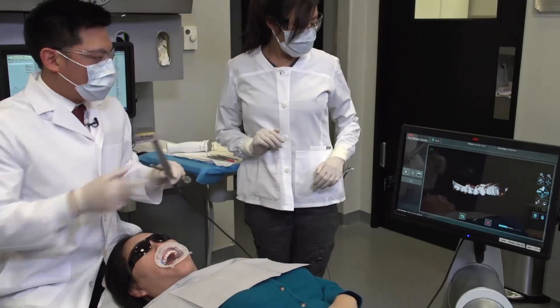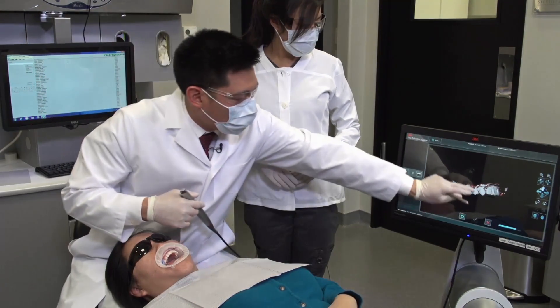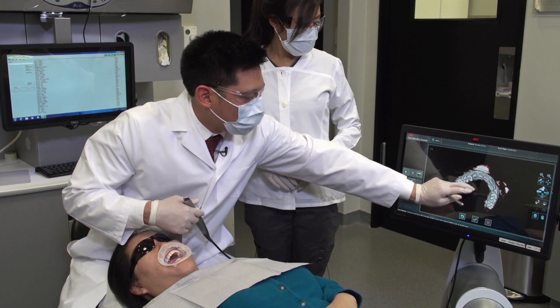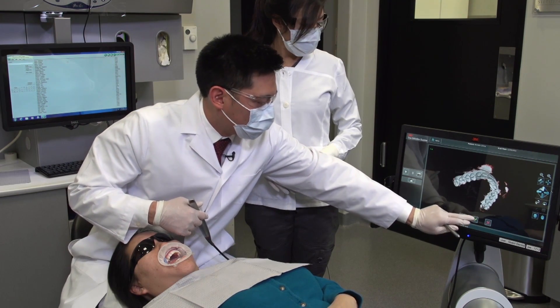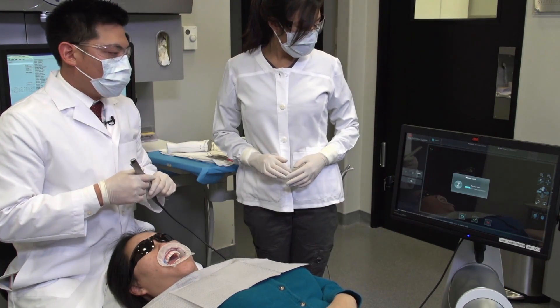We now have our completed maxillary model. I want to evaluate and ensure that all of the critical areas for this case are captured. In this case, we have all of the occlusal areas, buccal and lingual. We'll go ahead and accept the file. The next step will be to repeat this process for the mandibular scans.